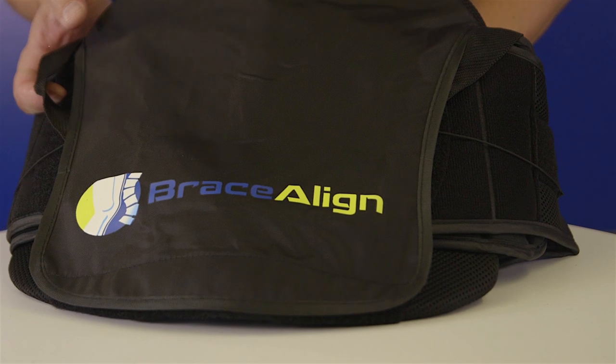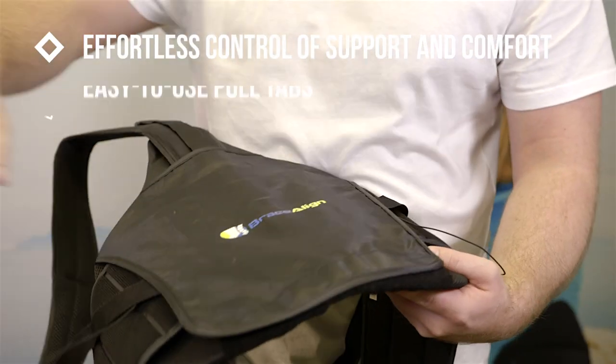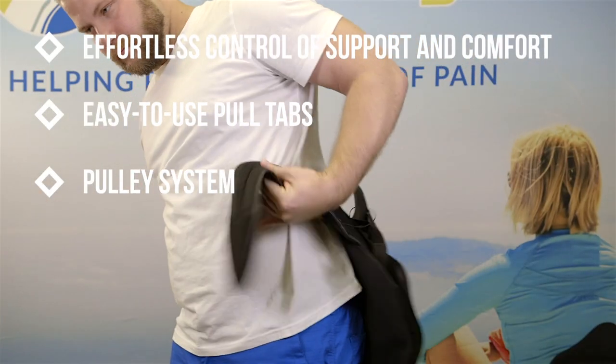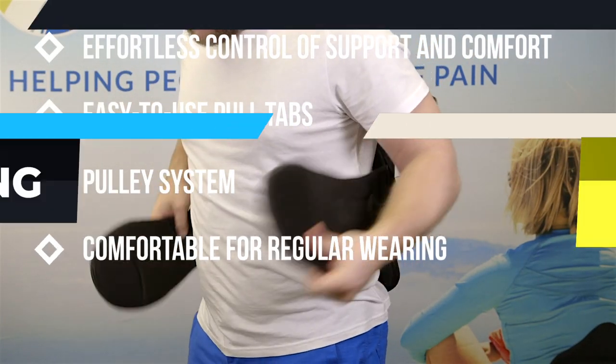Braceline's TLSO gives you effortless control of support and comfort with the easy to use pull tabs and pulley system. The TLSO is made with lightweight breathable material, making it comfortable for regular wearing.